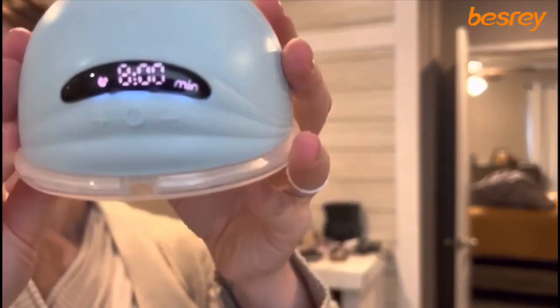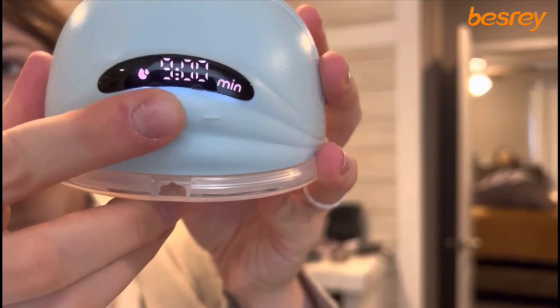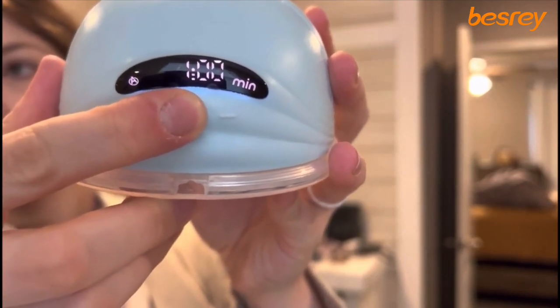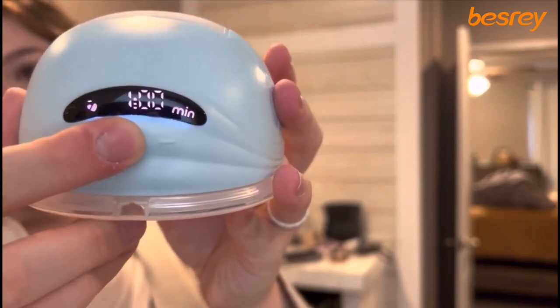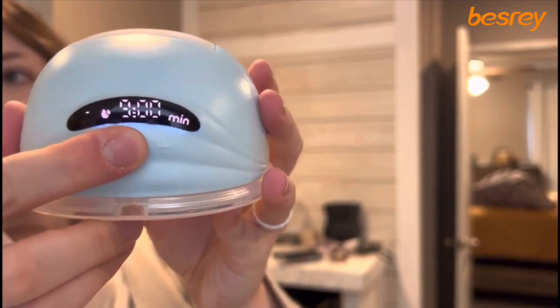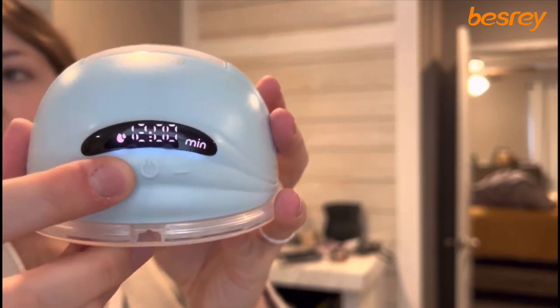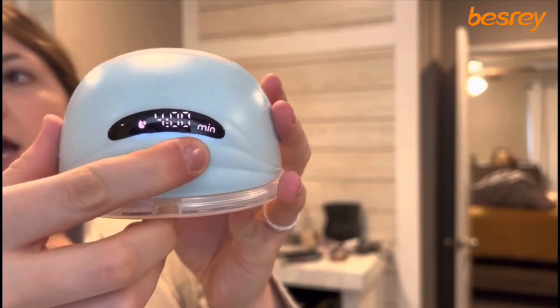The pump has a ton of different features. It has 12 levels for each mode and there are three different modes: a massage mode which helps with letdown, a combined massage and suction mode, and then just regular suction.